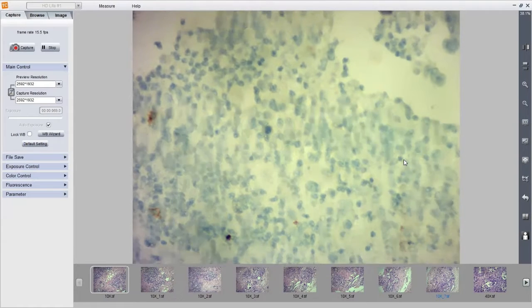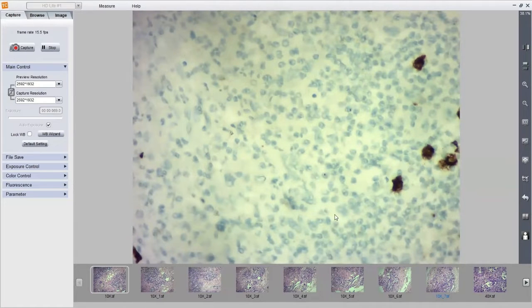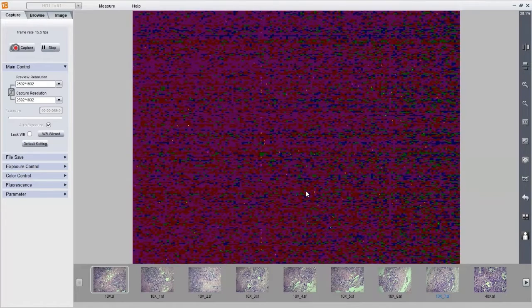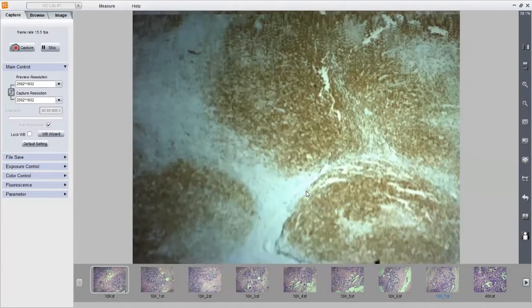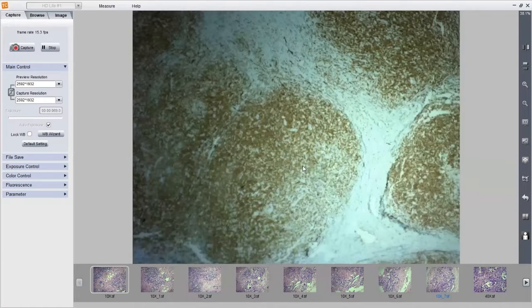I'll show you more. So the CD20 is definitely negative in the large cells. Yeah, it's negative in the large cells. We shall go and see the CD3. CD3 is definitely more than that of the CD20. So the nodules are very clear in this CD3 IHC. Okay. And the feature of classic Hodgkin lymphoma is that the background is T cell rich.